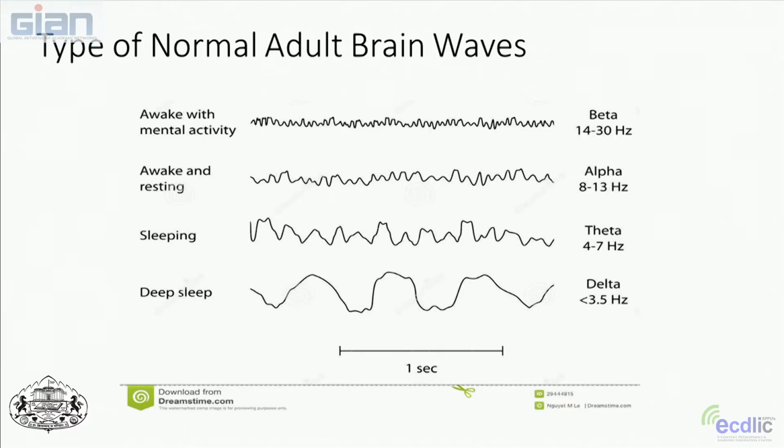Do you guys have signal processing background at all? Frequencies? Okay. It helps if you have some signal processing, but hertz is basically a measure of the frequency, so how frequently something is occurring. So when you see these waves, for example, the bottom one has a lower frequency. As you can see, the waves are slower, and the top one has the highest frequency in this plot.